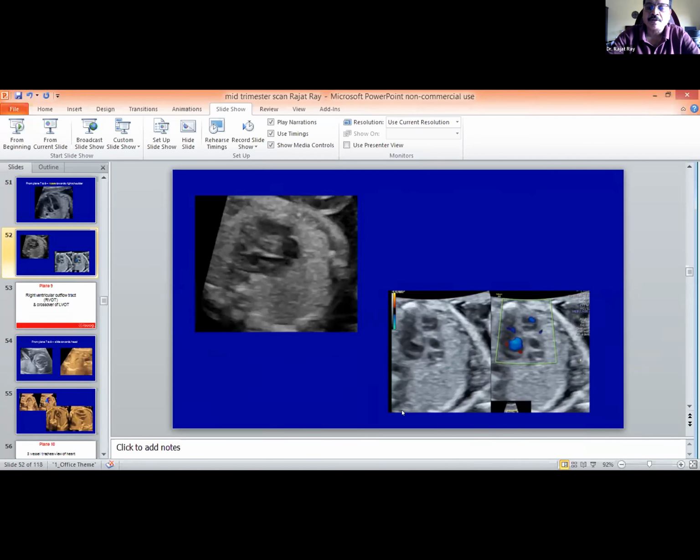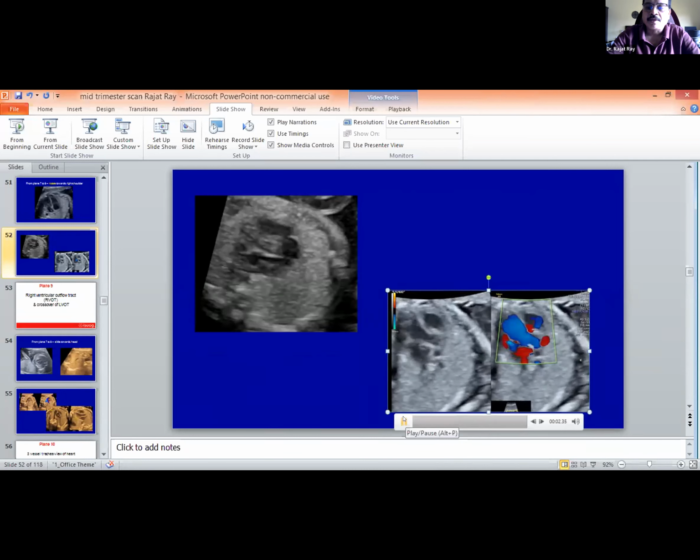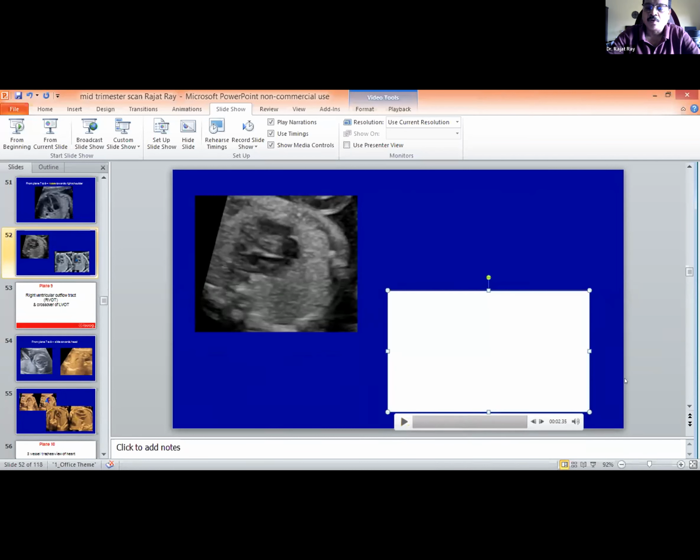And you always put on some color to confirm any color flow abnormalities.